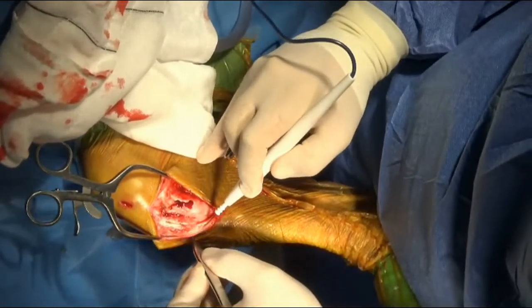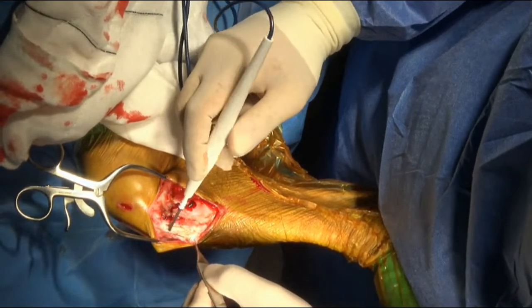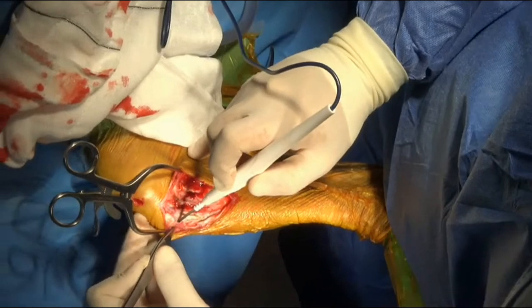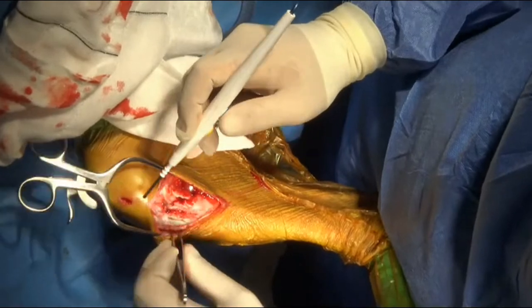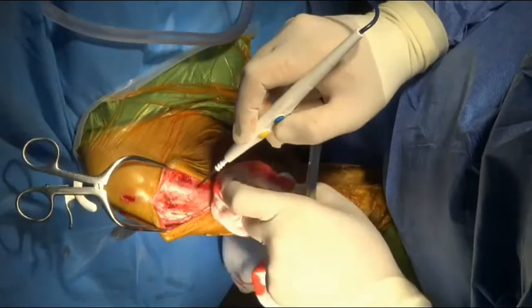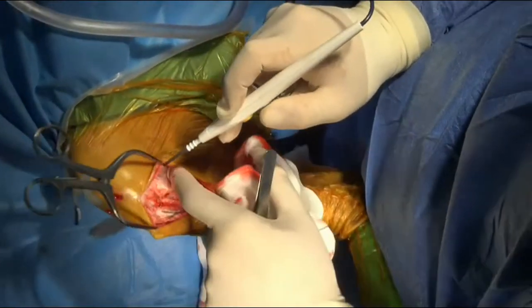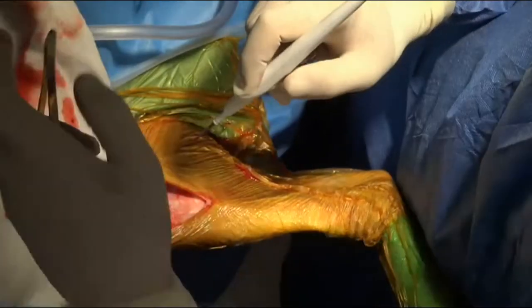But it does make it a little bit more awkward when I try and do that. Okay, so you can see the patella tendon here, the insertion of the patella tendon onto the tibial tuberosity through the Sharpey's fibers, just here. Just going to get a bit more exposure here. Can I get the table flattened out now, please, Jess? That's better. Not working down around my knees anymore.